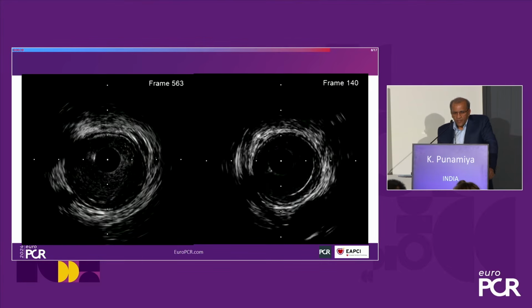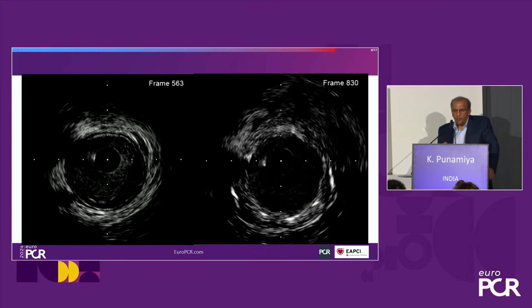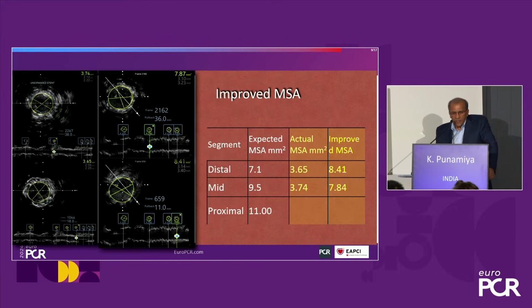These are the two runs simultaneously. I don't know why both are not playing together, but it just shows how beautifully the luminal space has been cleared and the stent expanded.